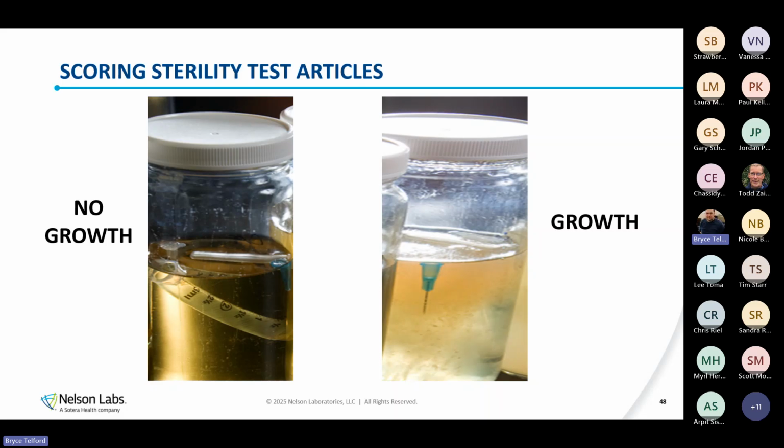So the issue we have is, okay, if I do a sterility test where I do just the fluid path, and as such, I'm just flushing the tube, I'm not leaving it exposed like here in this example. If I'm just flushing it, and I have a 50% recovery efficiency, well, how do I address that in a risk assessment? Do I test twice as many samples because it's a 50% recovery efficiency? Do I consider that I can only detect potentially half of the organisms, and is that acceptable as far as showing my sterility's okay?